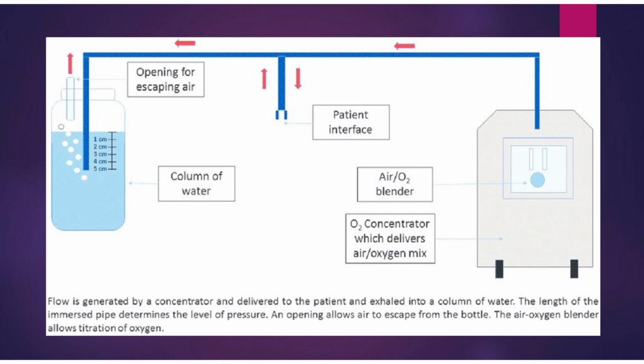Thank you very much. Thank you for the presentation. Very, very informative. Great, Elvis, that's really helpful. And I think that's really true. The oxygen meters are there. And most hospitals, actually, of late, I think UNICEF gave out a lot of them, but they're not expensive. We're not, as good as you suggest, measuring FiO2 for each individual baby.